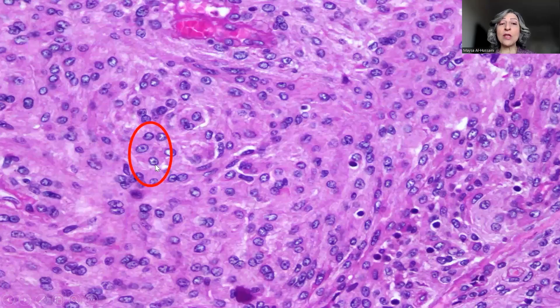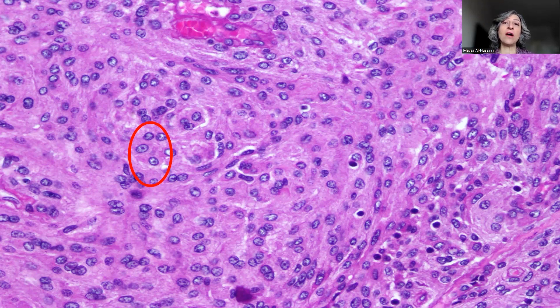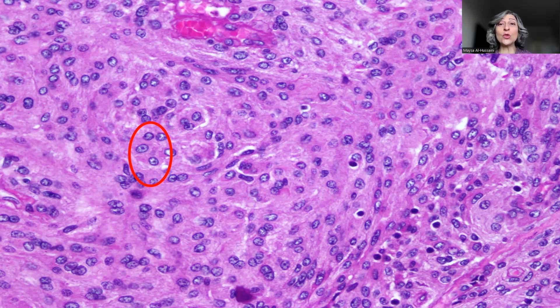So far we have three features that would support that this case is atypical meningioma. Number one, the spontaneous necrosis in the absence of history of embolization. Number two, the sheet growth pattern in the absence of a well-defined pattern of growth. Number three, prominent nucleoli. Remember that in the usual or classical meningioma, these don't contain any nucleolus — they contain inclusions, but they don't show nucleoli.